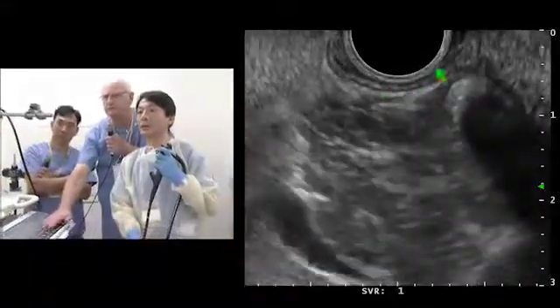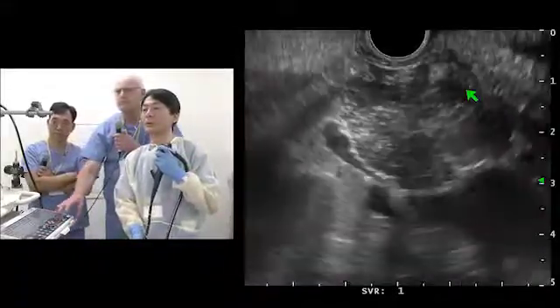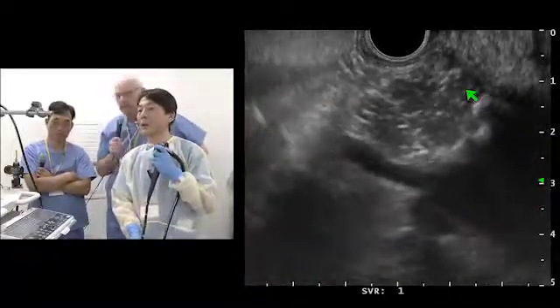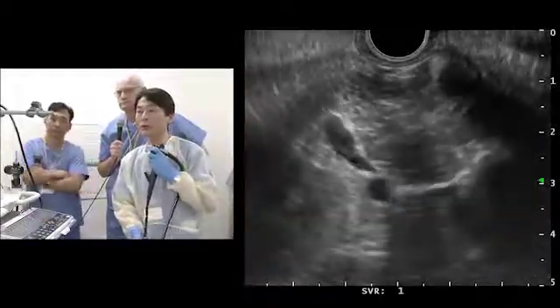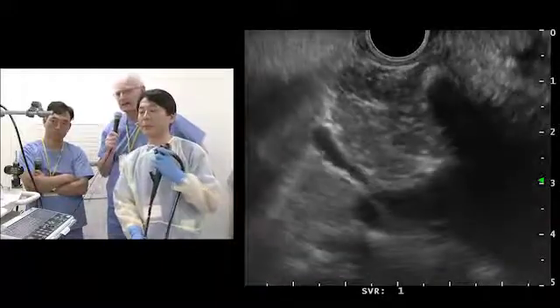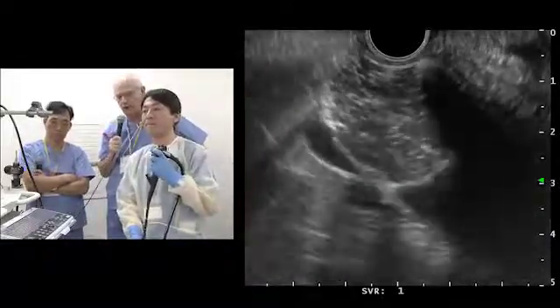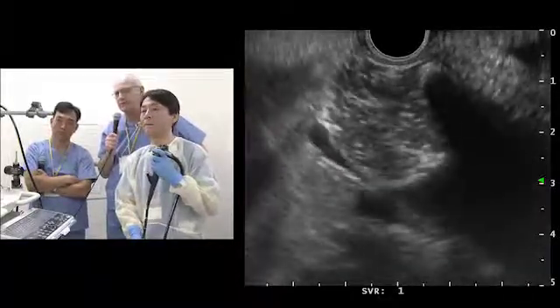Yes. And there seems to be an echo plane between. Do you agree? Agreed. Professor Rosawa, where are you in the duodenum? Is it in a short position or in a long position? Long position, but not stable. When we pulled back, we were in a short position at 60 centimeters, and that was very unstable. We've now gone in, about 75 centimeters, and it's a more stable position.